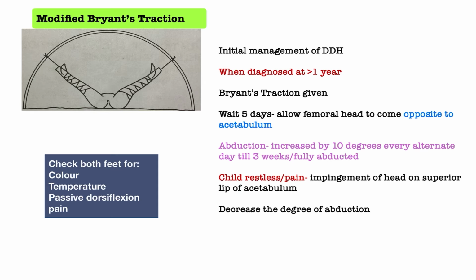If we do not wait enough, the femoral head might not have come opposite to the acetabulum, and it may cause impingement of the head with the superior labrum of the acetabulum.